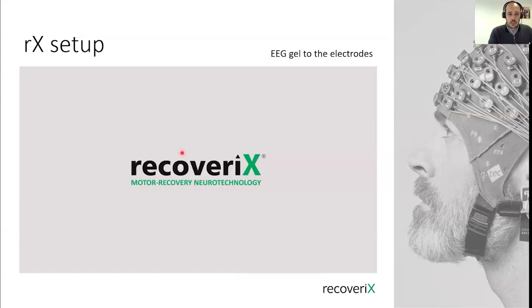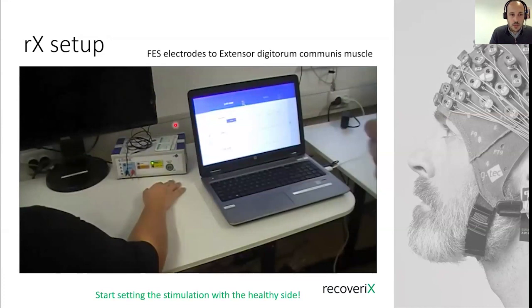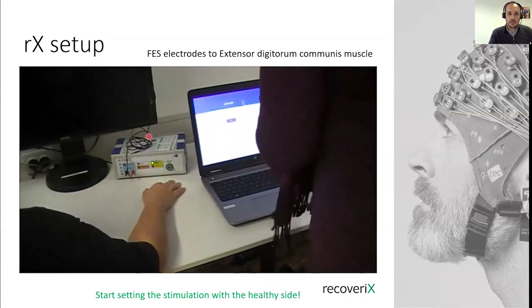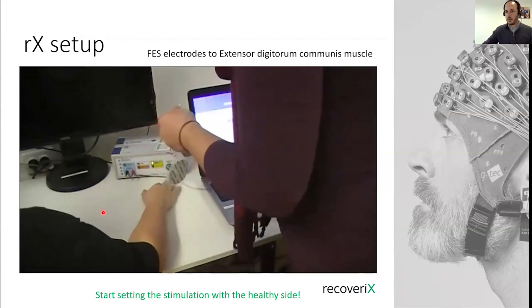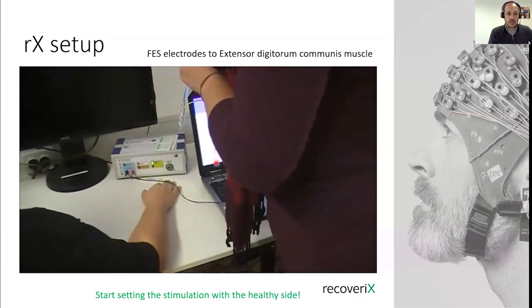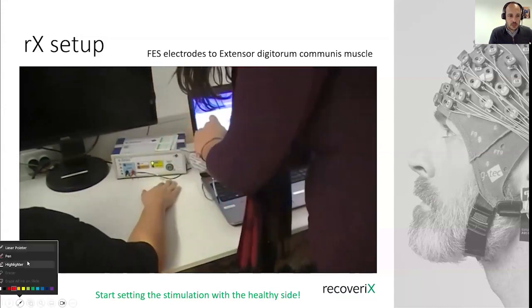So this is a video that's showing how the FES is set up. I'm showing it in a video because I'm afraid that maybe here you cannot really see too much of the procedure in detail. So first we have these electrodes.